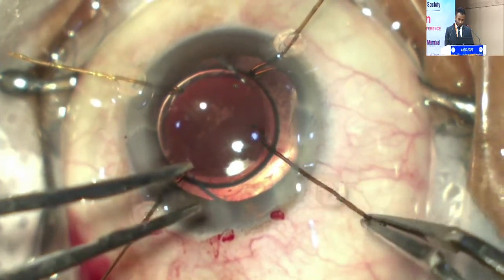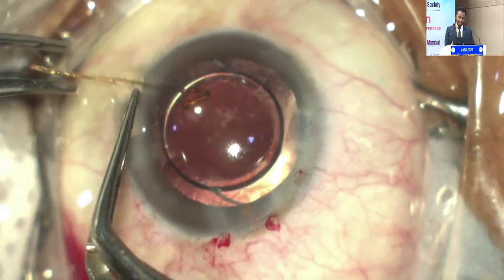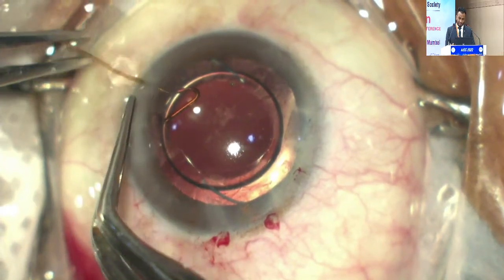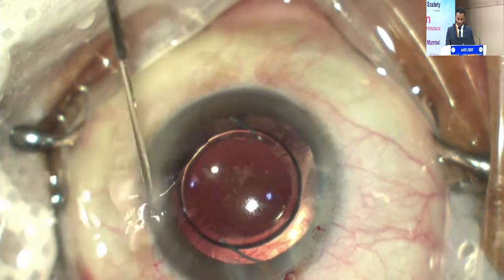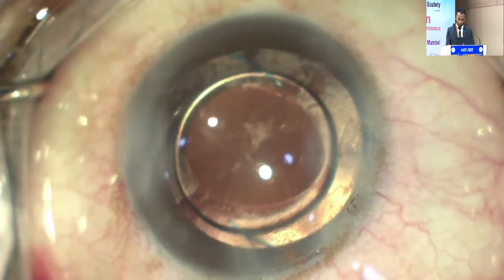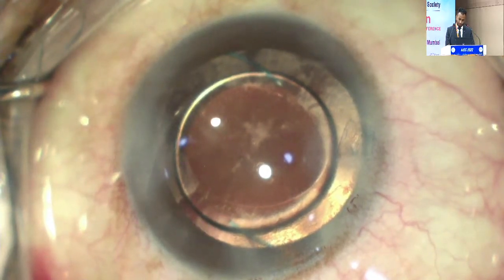Removing the OVD. The bag looks very stabilized. I didn't want to put a CTS segment because it was a young patient, traumatic, and I felt the lens was pretty stable. So I did not want to do too much intervention. And that's it. That was the end of the case.